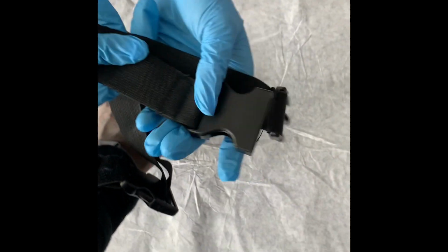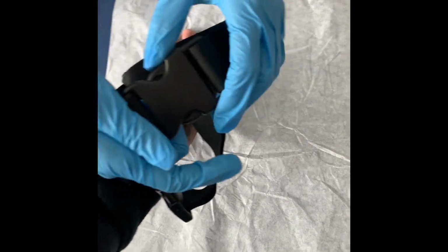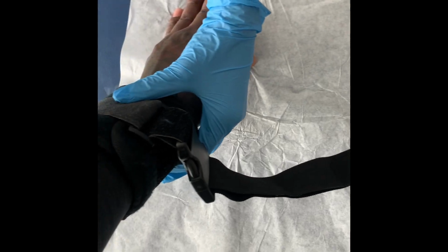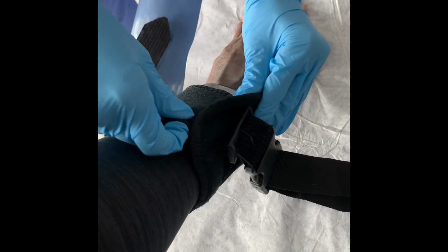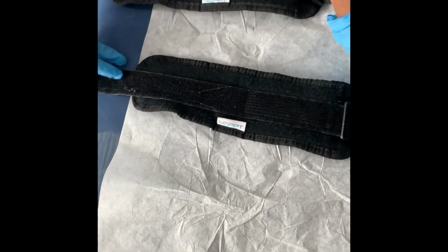Make sure this end is connected to the chair, the bed, as you can see. And of course, when the patient's in restraint, you want to make sure that you never leave the patient. You should be watching them every 4 to 5 minutes. You'll have a log sheet, just making sure that the patient is still alive and safe, making sure that the patient is not removing their restraints.